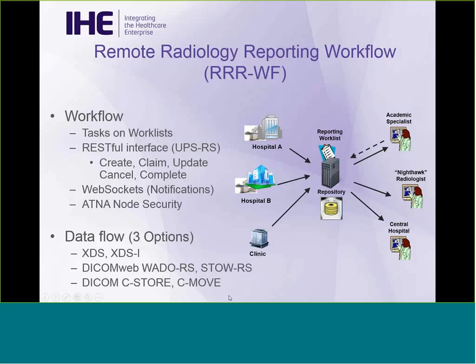The first is the XDS option. There are a lot of facilities that are using an XDS infrastructure. They've got a set of repositories and registries. And within IHE, we've worked out the XDSI extensions so that XDS can transport images from point A to point B, or at least make them available to be pulled, et cetera. So that's the first option.